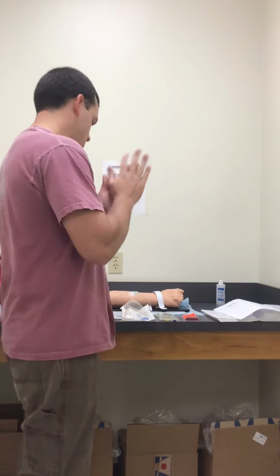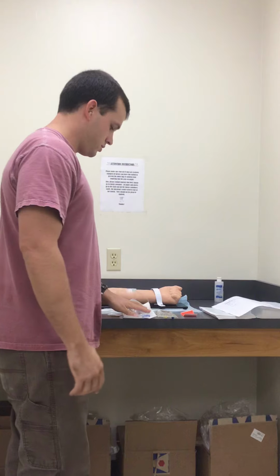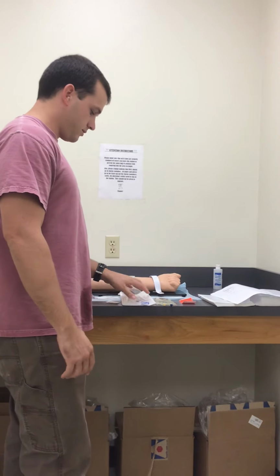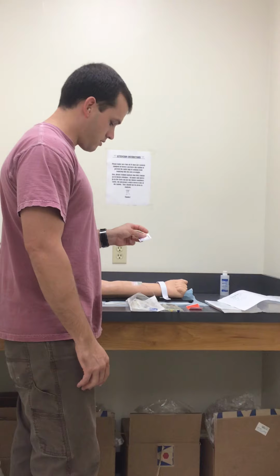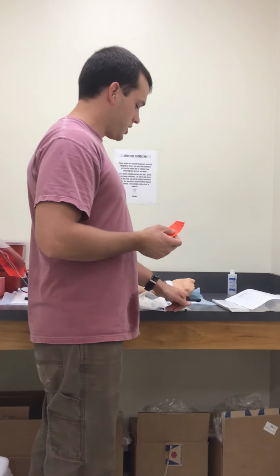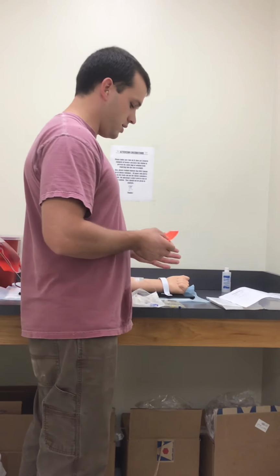I'm going to perform hand hygiene, get my equipment. I'm going to make sure that I have my drug that's pre-mixed, my secondary IV, my secondary tubing, my alcohol swab, and of course my label. I'm also going to check this drug to make sure that it is in date, which it is.